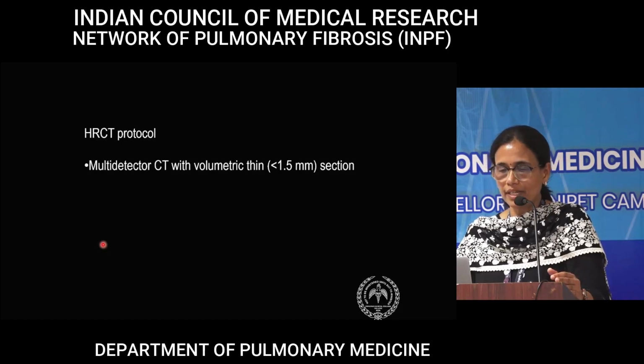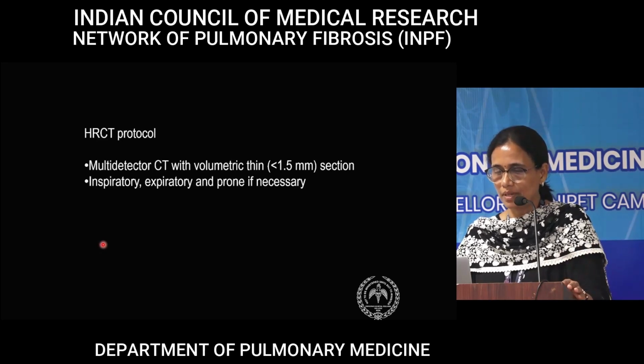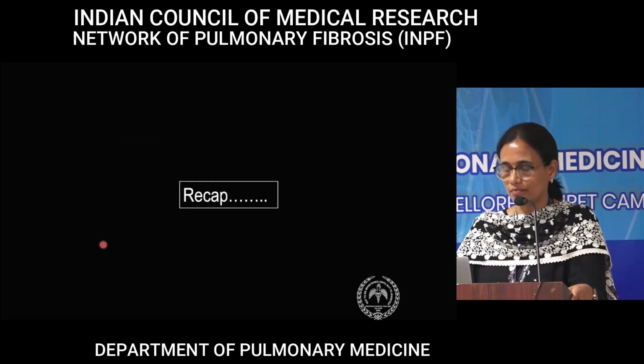The protocol we need to follow very strictly. By definition, slice thickness needs to be less than 1.5 millimeters. Inspiratory, expiratory, and prone images as necessary, we need to do all this. And the reconstruction has to be done in the high spatial frequency algorithm.